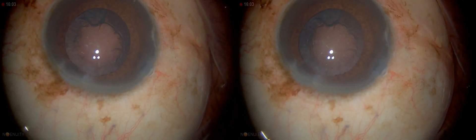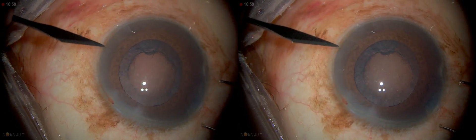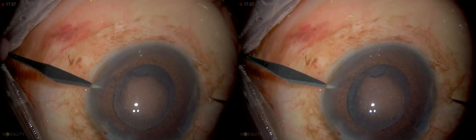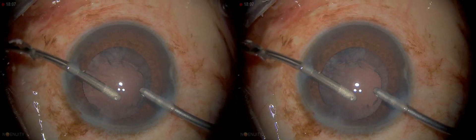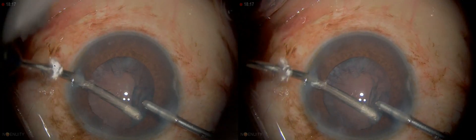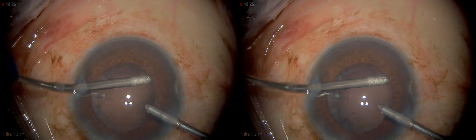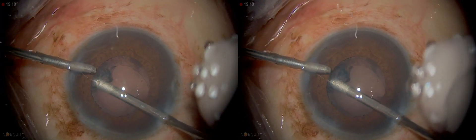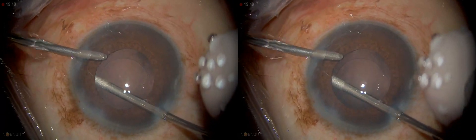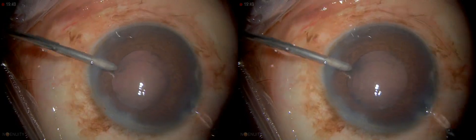This patient had asteroid hyalosis — we can see that now. Asteroid hyalosis is very deceptive because it makes it hard to judge depth. We're going to make a separate paracentesis site for our bimanual — ideally we would want to do this ahead of time. Irrigation is on; this is our IA now. You can really do a great job of doing tangential removal. Sometimes we remove the cells on the back of the anterior capsule. Usually we take this out first, and then we take this out.